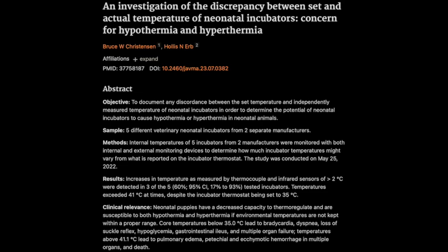And these little guys can't tell us what's bothering them. Right. We have to be really observant. So any change in their behavior could mean something is up. And remember, neonates are especially vulnerable to temperature changes. Because they're so small. Exactly. And they can't regulate their own body heat very well. So we have to monitor them constantly, especially in those first few hours after they're born. Makes sense. So that's why the veterinarian in this study was checking the incubator.